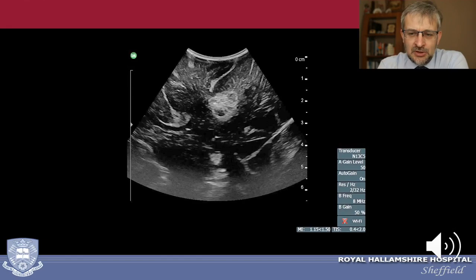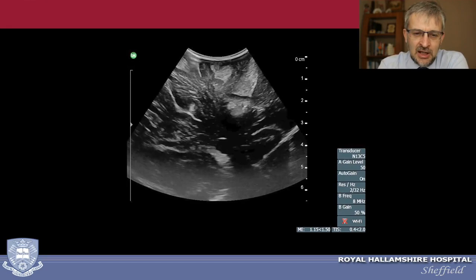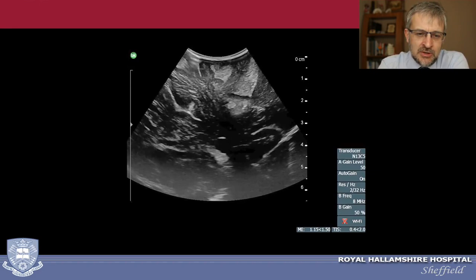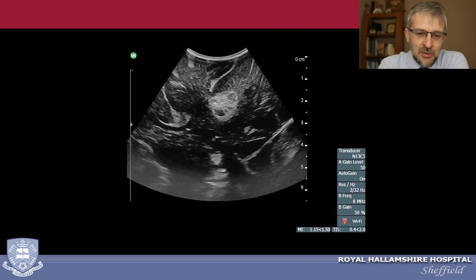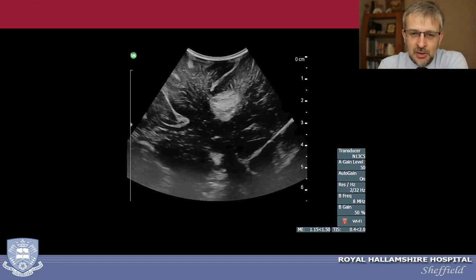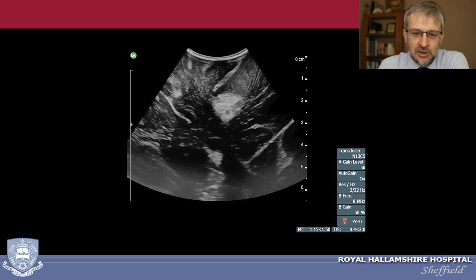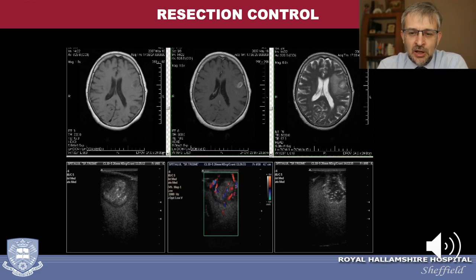The modern ultrasound machine gives you a much better picture with a scale so you can see exactly the size of the abnormality. You can identify a tumor located just at the bottom of a sulcus, follow the sulcus, and have a really minimally invasive approach — hitting directly the edge of the metastatic lesion and removing it without causing any unnecessary brain tissue manipulation or new damage.